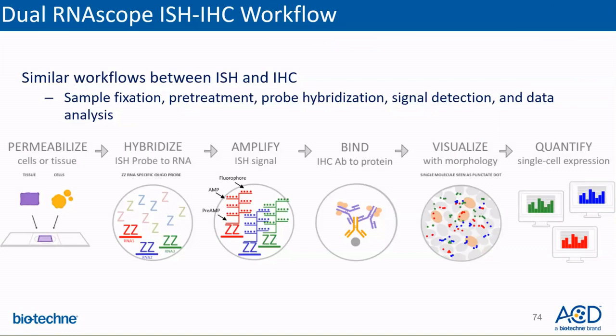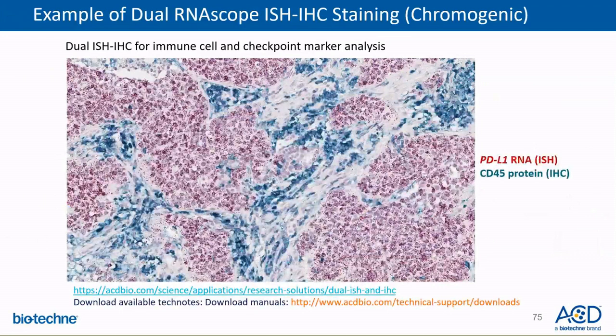Here is an example of using the RNAscope single-plex red assay to detect the PDL1 probe with subsequent IHC staining in blue for CD45 protein.